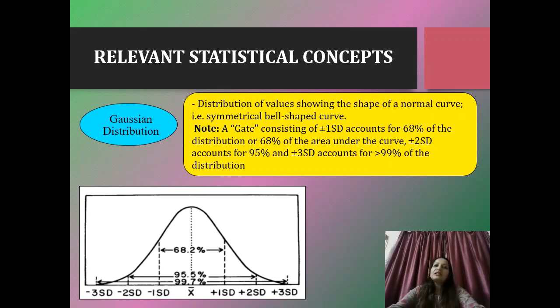Say a manufacturer has given the blood glucose normal biological reference interval as 70 to 100 milligram per dl. Whether that 70 to 100 is applicable to our population or not, for that purpose we have to take at least 20 for verification. Of course, for validation purposes the number is very vast.